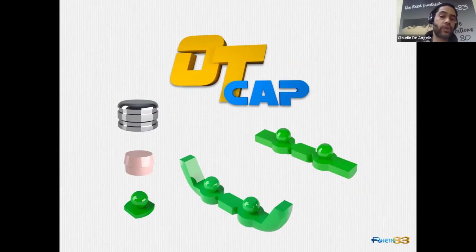Remember, we also have the micro size of this attachment, which will be in red color. The green and the red are of castable plastic. Okay. So you have the straight bar, but also the beveled bar, and also the single sphere.